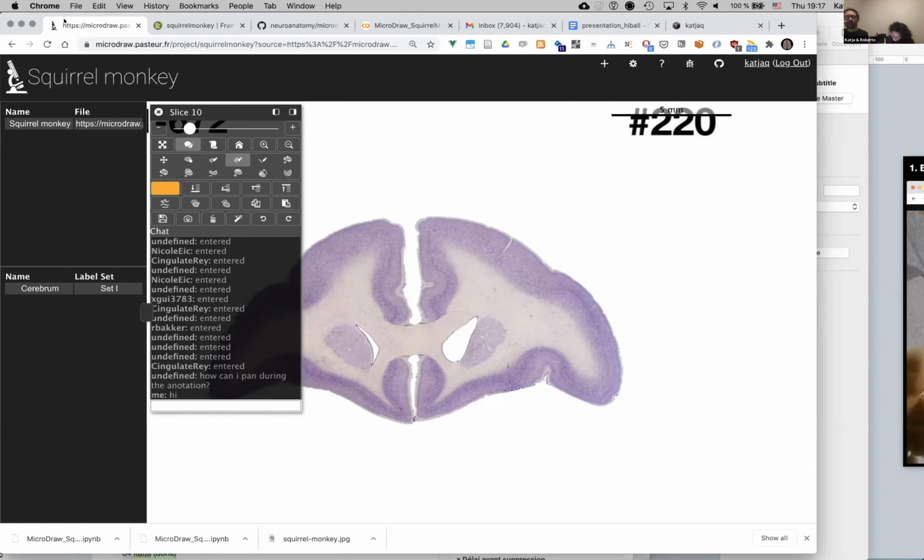Normally with the polygon tool, just by clicking, lines get connected. But if you draw, for example, one circle, and then you want to combine it with another circle to make a bigger shape, there's a tool for joining regions. It's called Add Region. You select the first region, then you select the Add Region tool, and then you click on the second region, and the two of them will be fused into one.